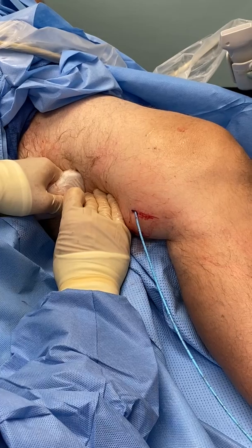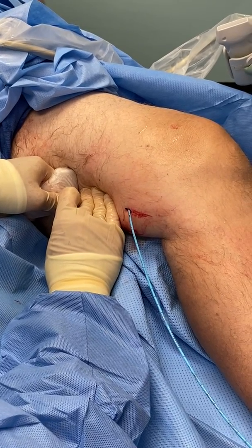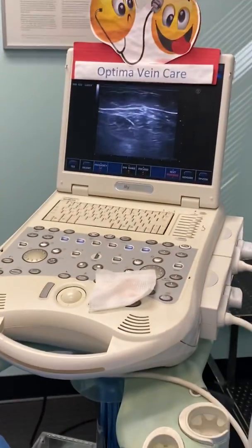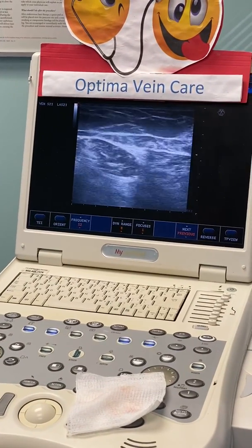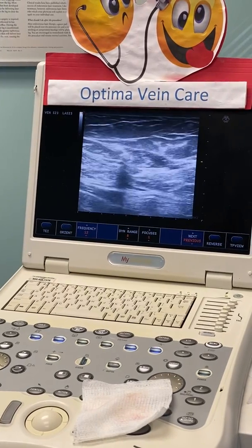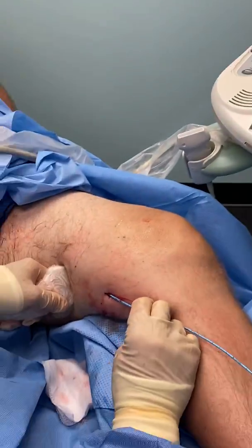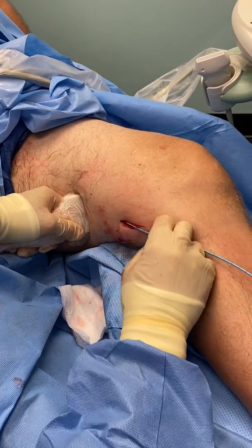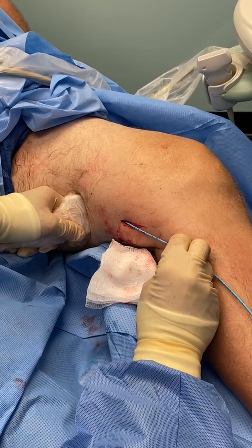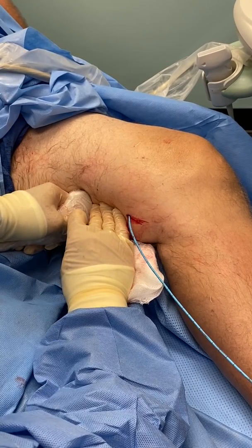How are we doing time-wise? Four seconds — hold on just a second, I want to see where I'm at. So we're getting closer, right about here. I'm just going to do one this time. Go ahead — one one thousand, two one thousand, three one thousand — one, two, three. That's the last one I'm going to do; we're going to hold this down here for one minute.